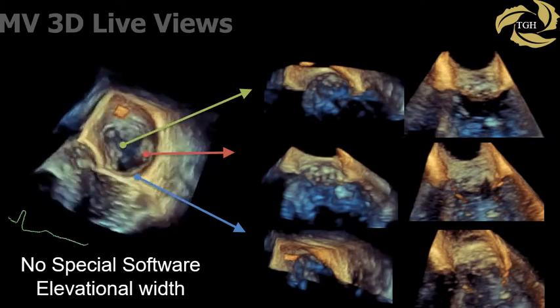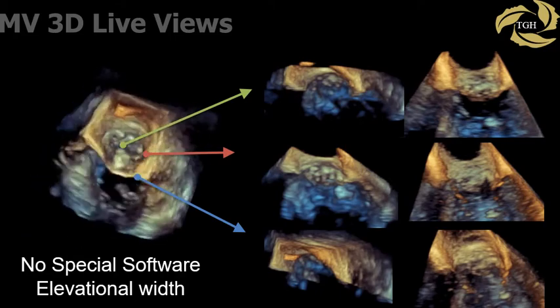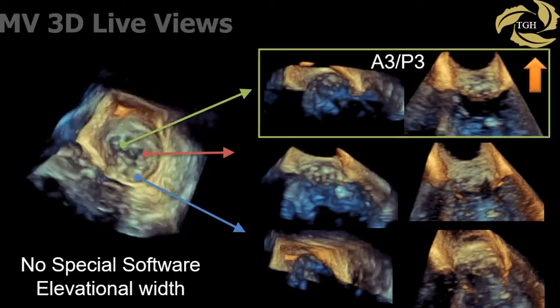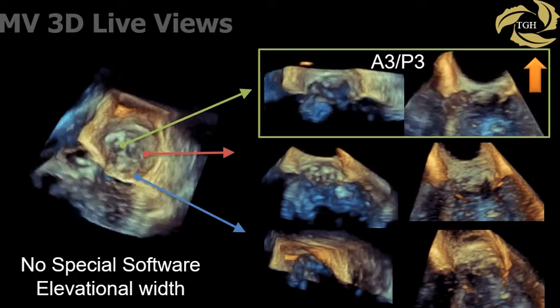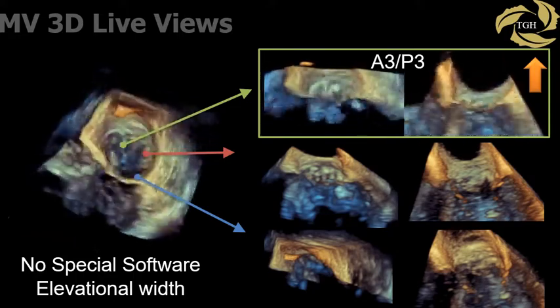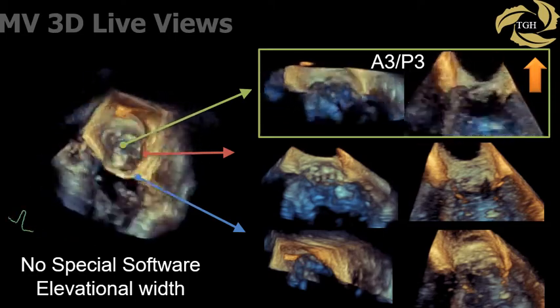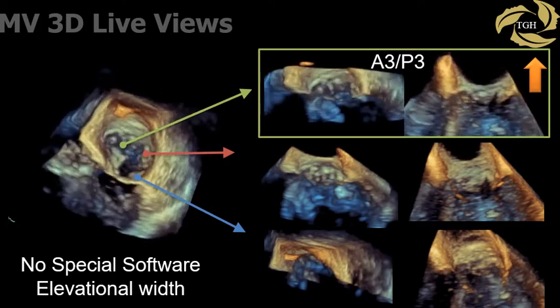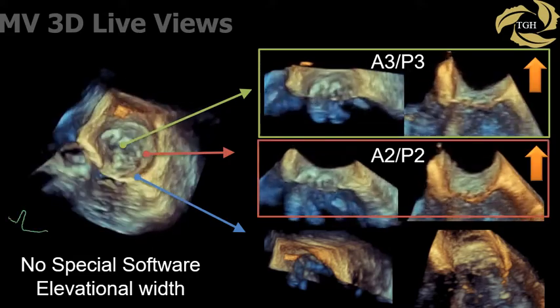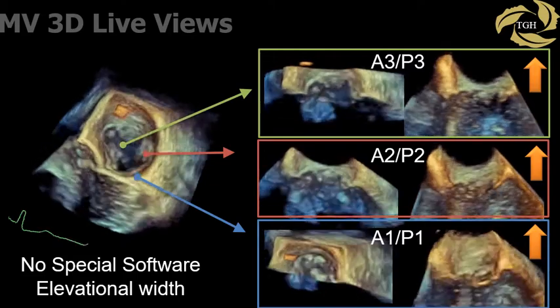Another technique is the live mode, to obtain a 3D dataset of the mitral valve at 0 degrees in a four-chamber view. The elevational size is adjusted to show the entire valve or more or less of the mitral valve. Rotating the image slightly upwards cuts through the mitral valve in a sagittal plane to determine leaflet motion in relation to the mitral annulus. Shown here are cuts through A3-P3, A2-P2, and A1-P1.